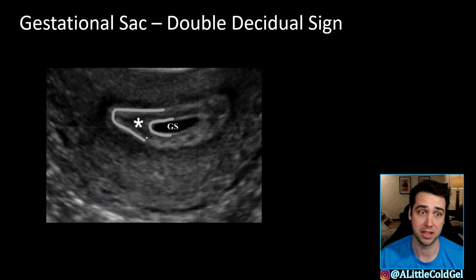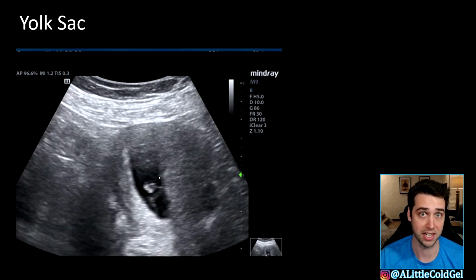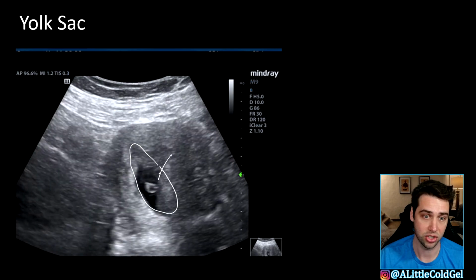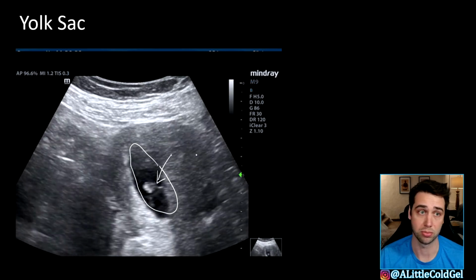Some people talk about this double decidual sign as one of the first signs of pregnancy. It is somewhat subjective, so in the ER, you shouldn't say that a pregnancy is intrauterine just because you see the double decidual sign. I would go more off the yolk sac. So this is kind of what we say is the first definitive sign of pregnancy. So here you see the gestational sac, and then this little Cheerio in the middle right here, that's the yolk sac. And so if you see that within the uterus, this is a definitive intrauterine pregnancy.